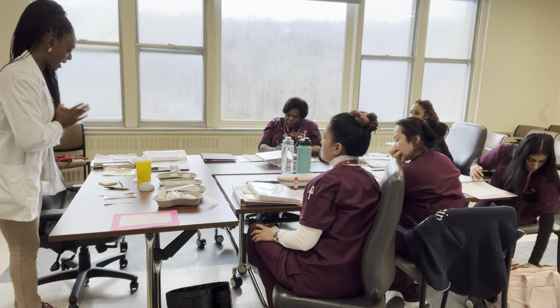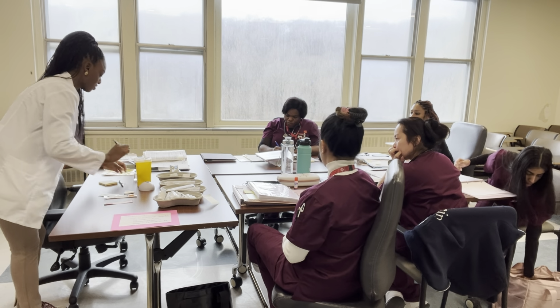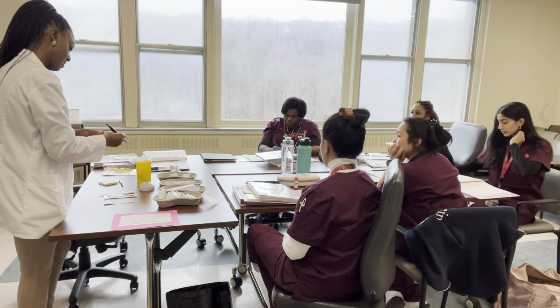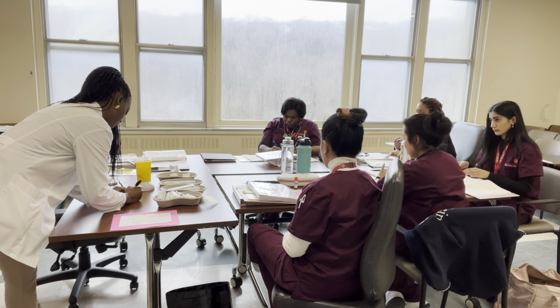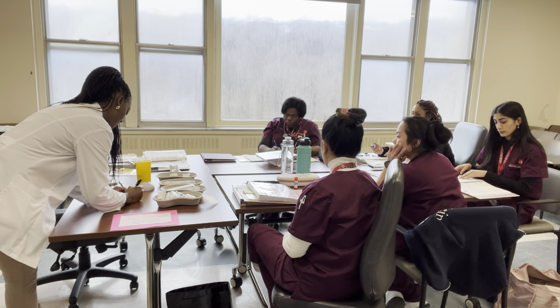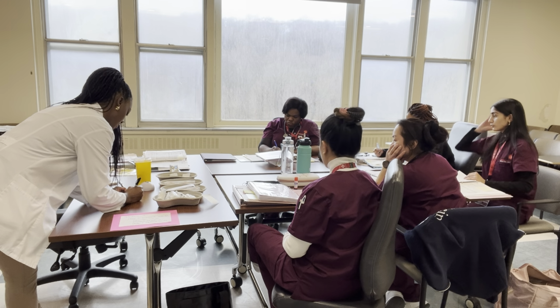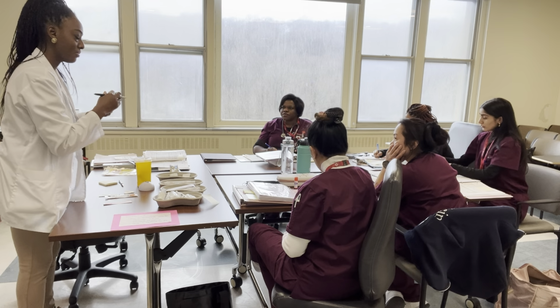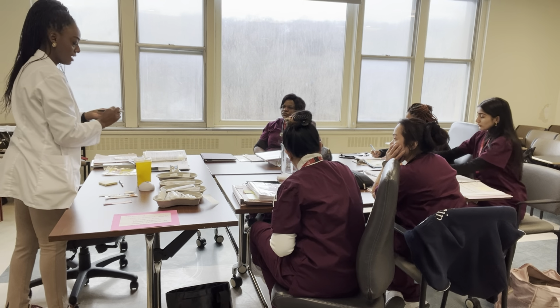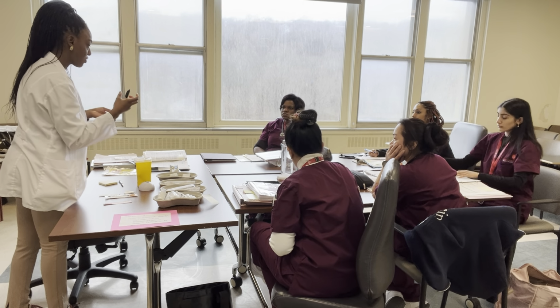So, I will resume the process. So we will write the date that we opened it, which is today, April the what? Okay, and then we put the year, okay? So is there anything else we're missing to check? Beautiful. We look at the concentration, and usually it's, what is the concentration of the drug?